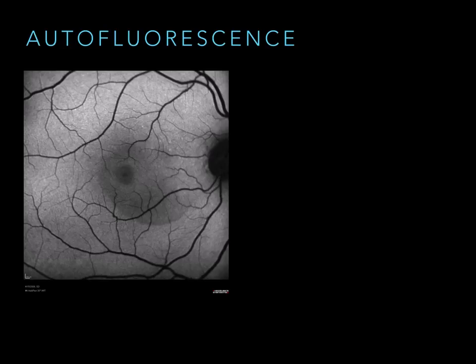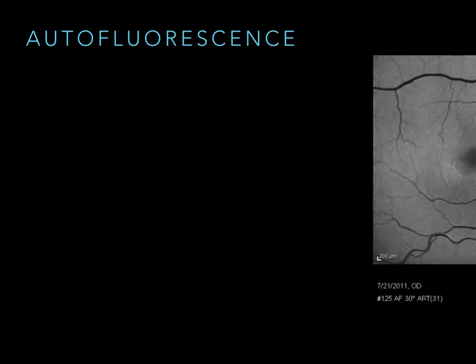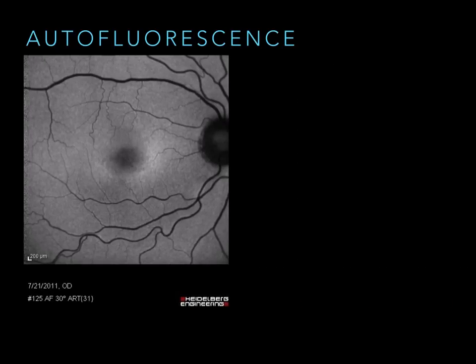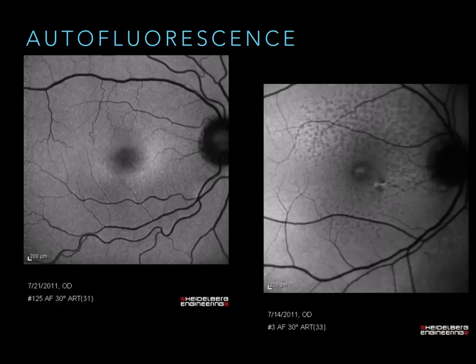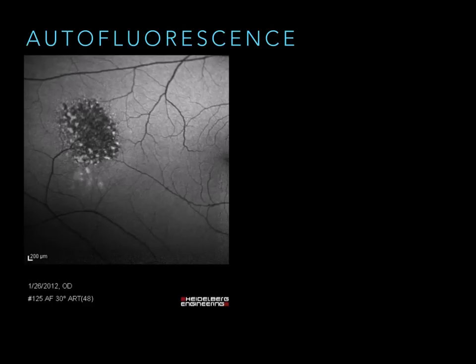This is subretinal fluid. Again, it attenuates that signal, right? That's due to acute CSR. This is chronic CSR. This is that guttering thing you hear me talking about all the time. It's got hyper on the edges, hypo in the middle, unhappy RPE all around. This is a patient with chloroquine toxicity and hydroxychloroquine. And we've got somebody with subretinal drusen in this leopard pattern. This is a nevus, or maybe a small melanoma that's got orange pigment. I'll talk about that more next week.